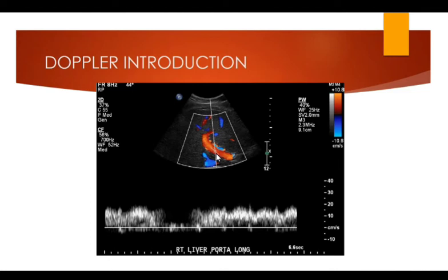And what we can see is that this is red. We can see our positive number up here. We've put in this little range gate. We've got our spectral waveform. We can see our positive numbers on the top, and we can see our negative numbers on the bottom.